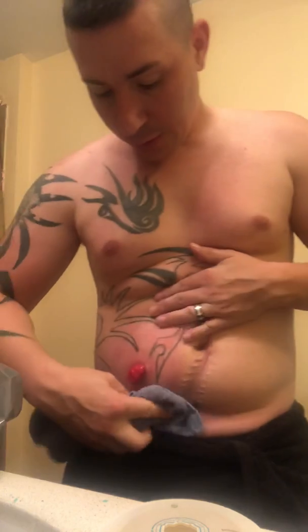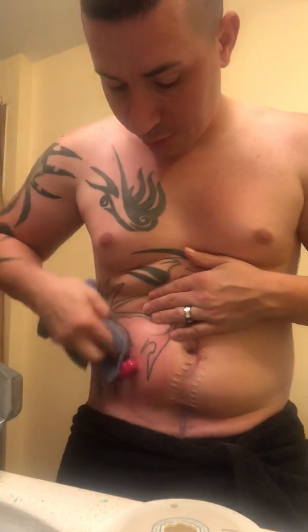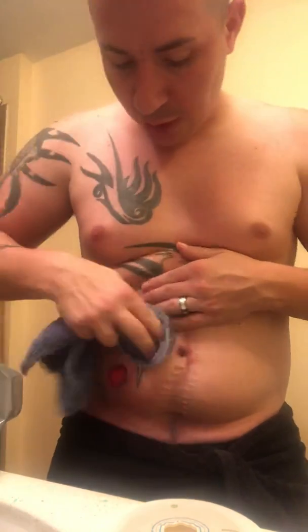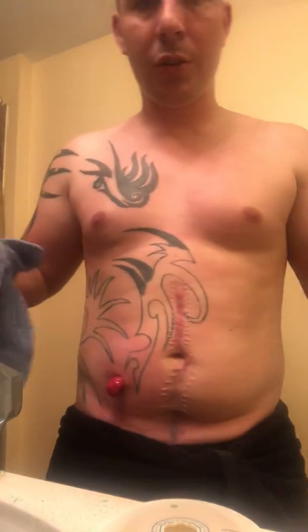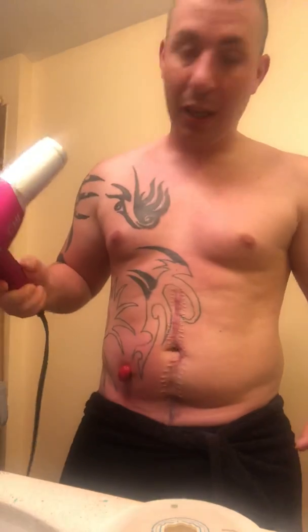So my first step is to ensure the area is completely dry. I use a washcloth to dry the entire area. And then for those of you who are married and share a bathroom with your significant other, like I do, I take my wife's blow dryer and I blow dry the area as well.